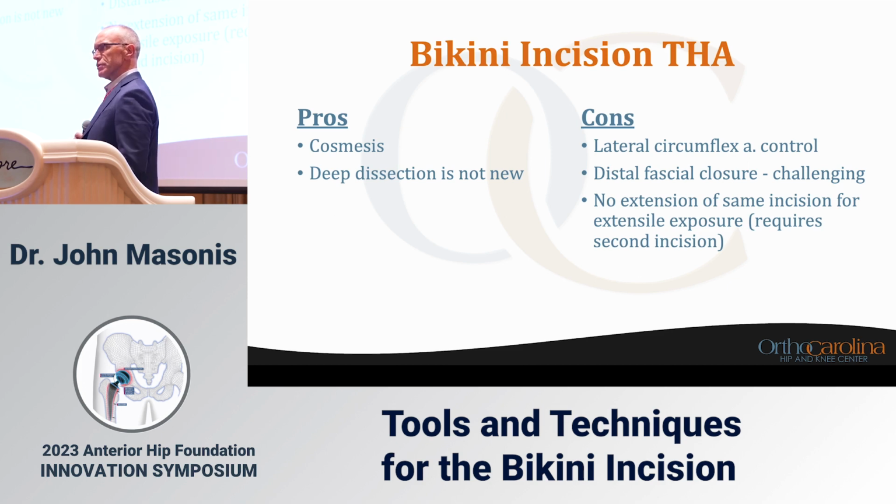Because when you do your vertical incision, usually in the inferior portion of your incision, you can easily identify these vessels crossing anteriorly, and I think Christoph talks about preservation of them, but they're pretty easy to see, find, ligate, or cauterize. When you do the bikini incision and if you run your dissection then distal, frequently you don't have great access to them, so it can be harder to control them.